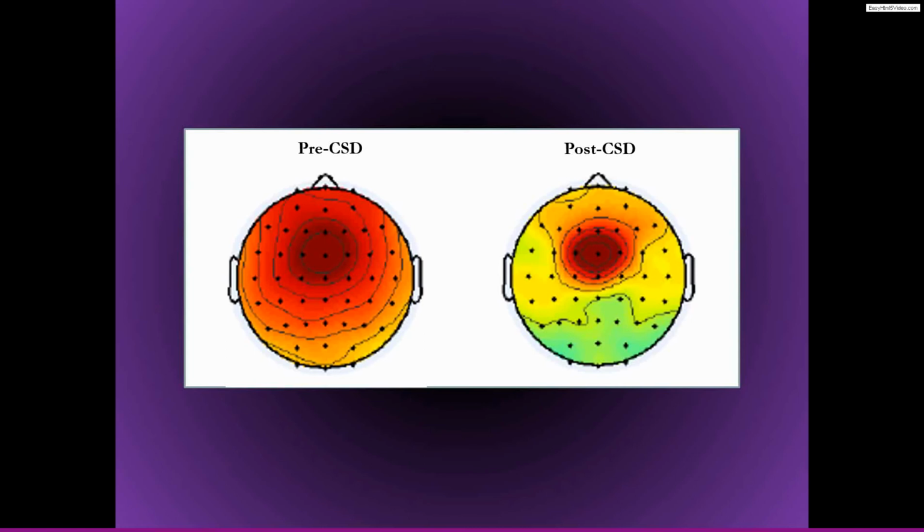In this context of the Laplacian, we can talk about the topographical source of the activity. We're not necessarily making any inferences about exactly where in the brain the signal is being generated, but we're just using the term source to identify the electrode where the topography is maximal.